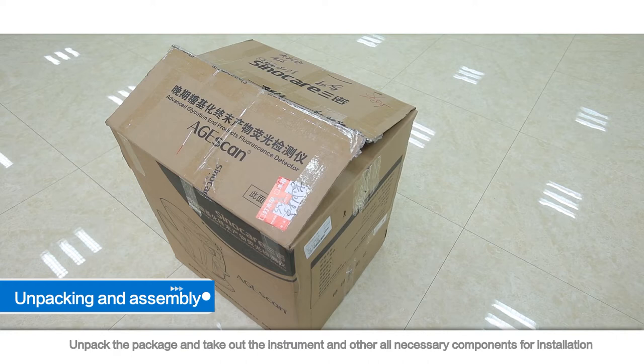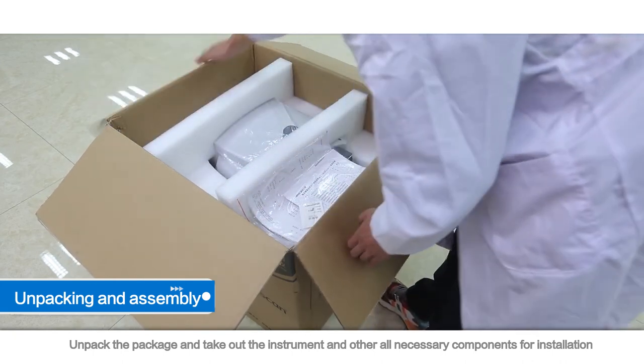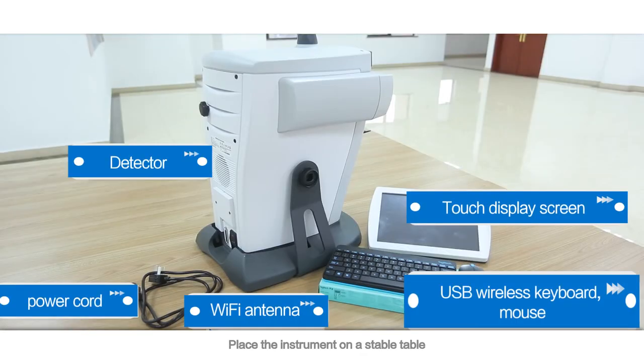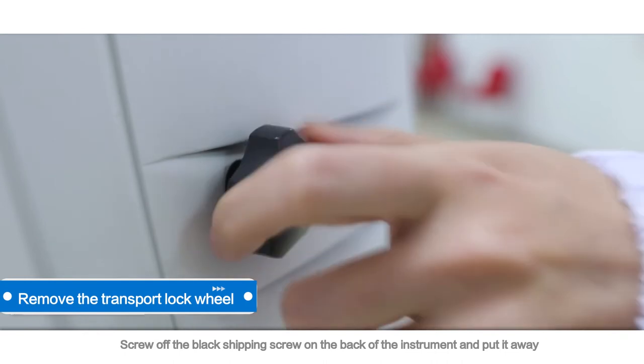Unpacking and Assembly. Unpack the package and take out the instrument and all other necessary components for installation. Place the instrument on a stable table. Screw off the black shipping screw on the back of the instrument and put it away.